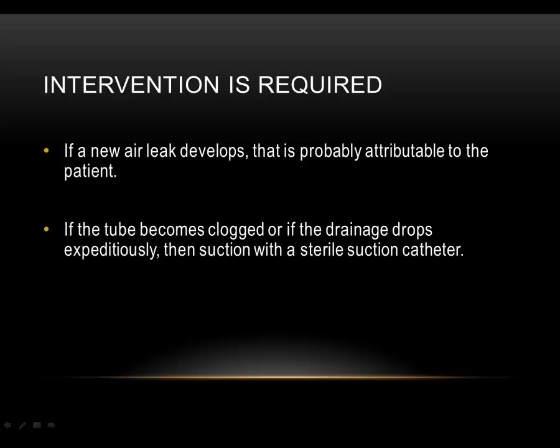If drainage abruptly slows or stops, the provider should suspect occlusion, perhaps by a clot. Newer tubing contains a non-thrombogenic coating to prevent clotting. Use a gentle squeeze and release motion on small segments of the tubing to help drainage move through. If drainage cannot be reestablished, consult with the doctor.